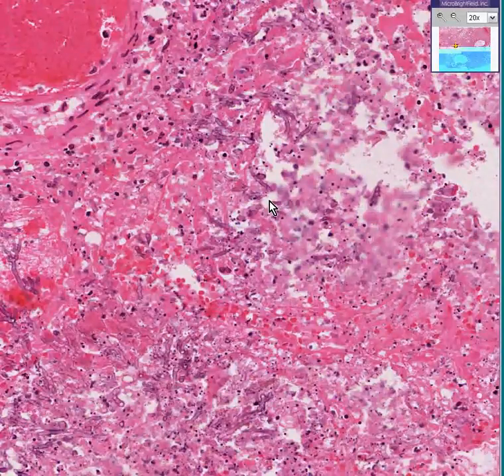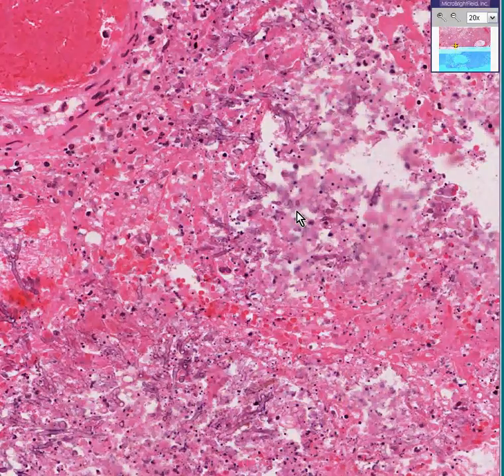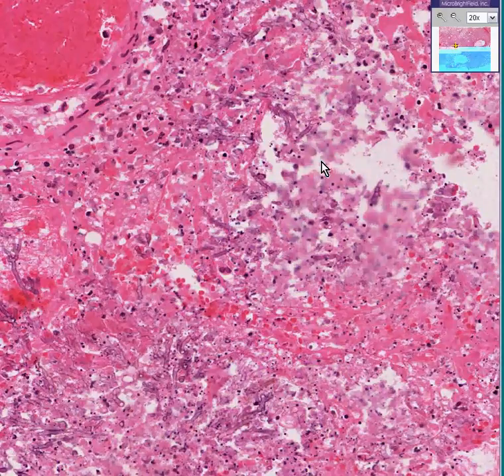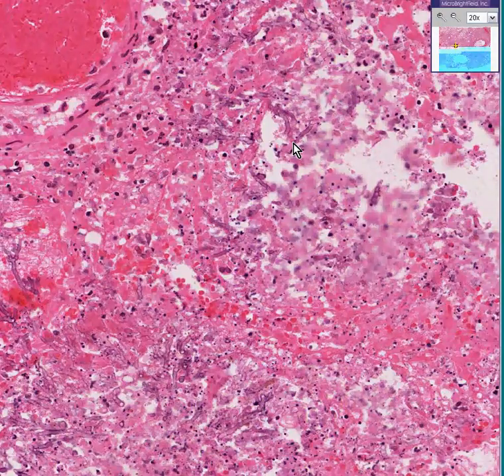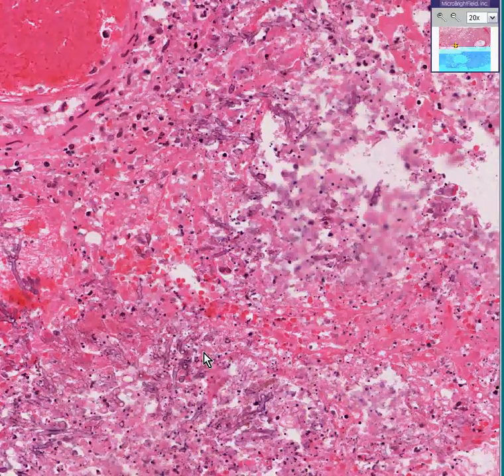Now that we are attuned to realizing that in the middle of this debris are fungal hair balls, we at least know that this pneumonia is caused by a fungus. Even though we don't know the exact genus and species, we can say it's hyphae, it branches, and if we look closely we can see it has septae between the hyphae. If you plug into a pathology book the differential diagnosis of septate, branching hyphae at perhaps a 30 to 45 degree angle commonly involving the lung, the first thing on the list would be aspergillus.